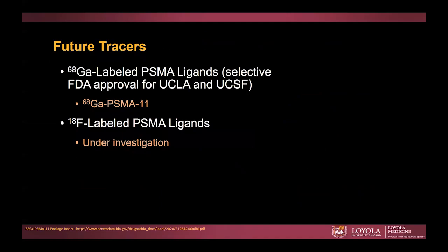Going into the future tracers, we do know now that gallium-68 PSMA-11 was recently approved for selective use in California. And we do have other tracers that are F18 labeled and are under investigation, and I'm not going to cover that in my lecture today.